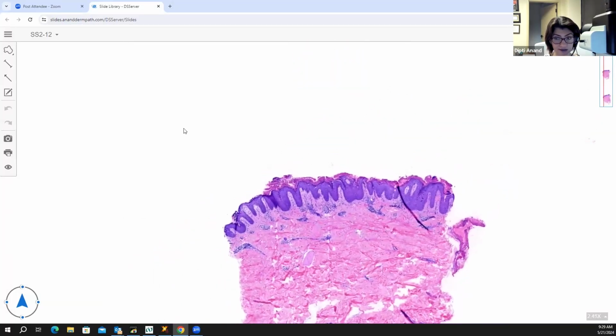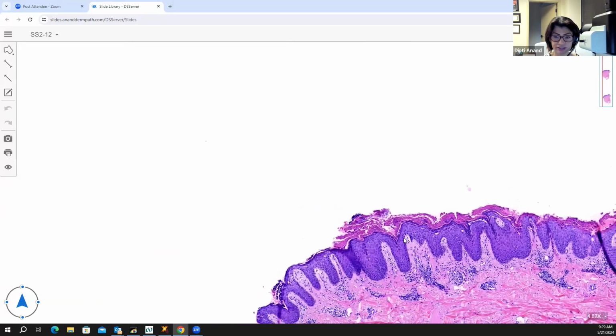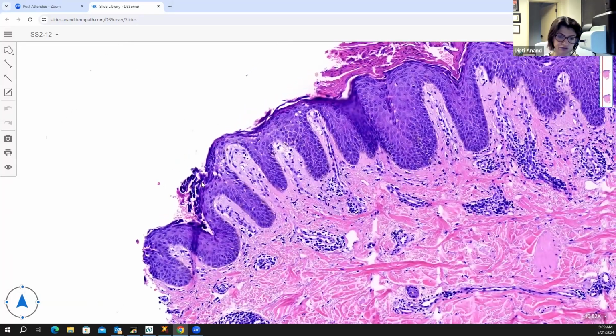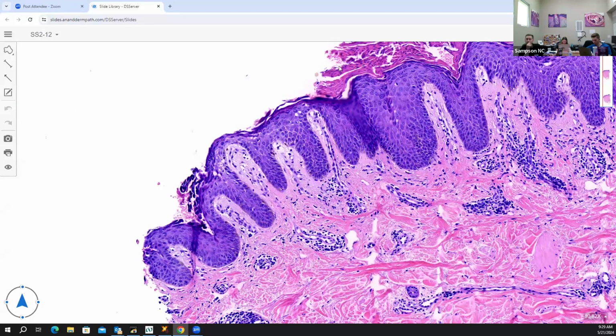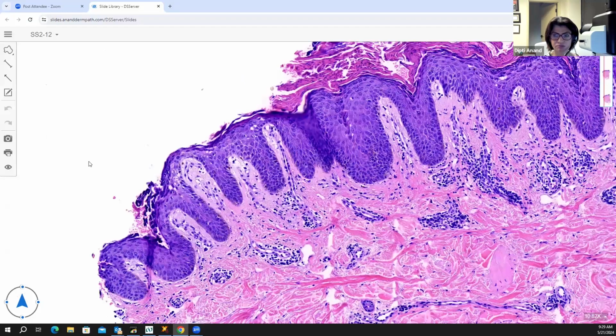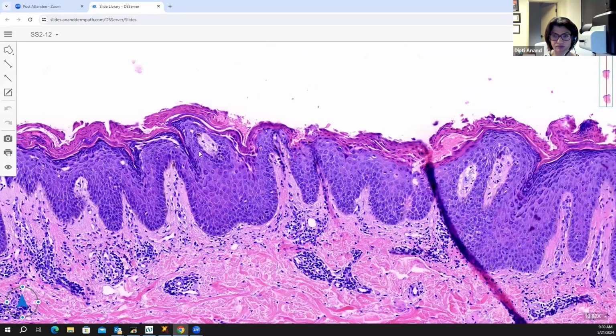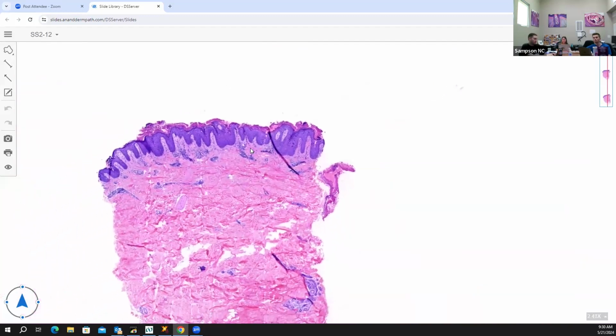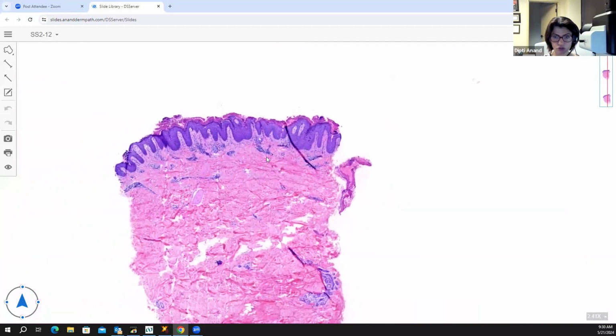It could also be staphylococcal scalded skin syndrome. So if they have that in the differential, then you will have to look for a second order question. But you see how weird the granular cell layer looks here? Yeah. And there's clearly no stratum corneum. So that's pemphigus foliaceus. Gotcha. Okay. Everybody good with that? Yes. Yep. This is important. Whenever I see a weird looking granular cell layer, after some time your eyes become really accommodated to it, but that's something that you really need to think about.